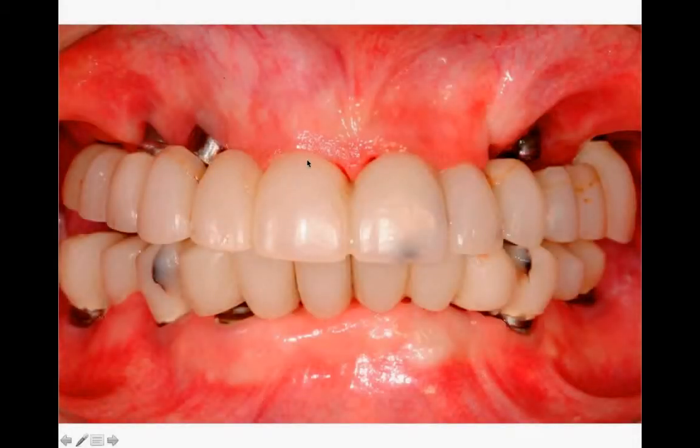Then we complete the upper, and I would turn around and do the lower against something that's already cemented. In this case, we're showing a case that Dr. John Kois had presented at a recent symposium. This was a patient that he had inherited, and there were some aesthetic issues. Regardless, we have some implant issues and soft tissue issues, but we work with what we have sometimes. The provisionals were presenting as such. The occlusion doesn't look too good, and I want you to notice these stain areas here, because this makes this anterior section removable later for a segmented bite.